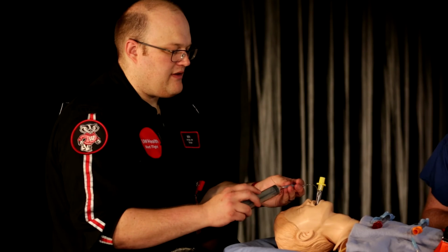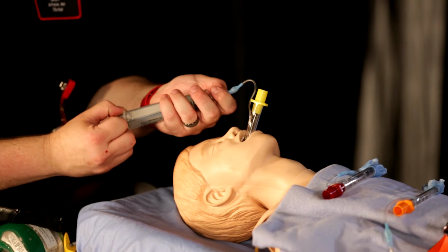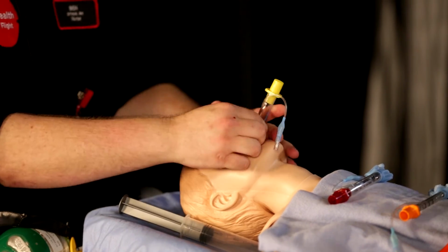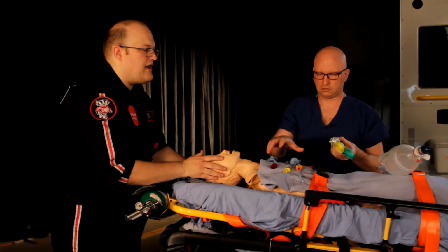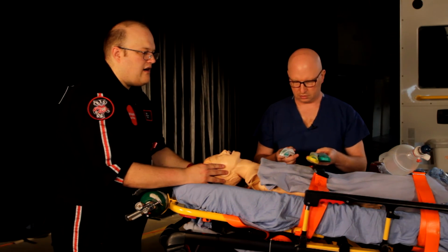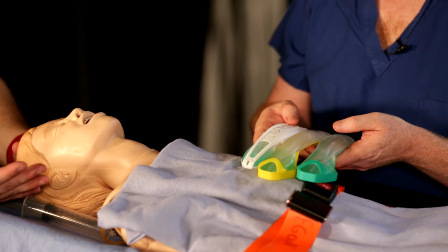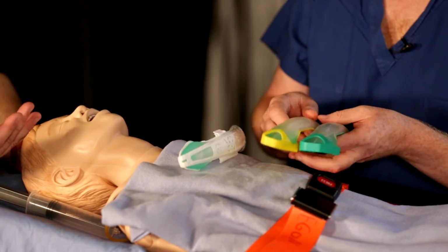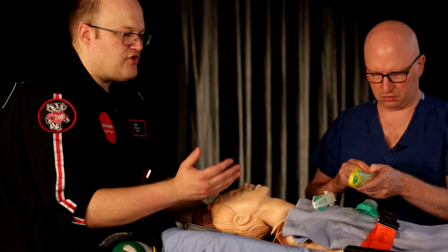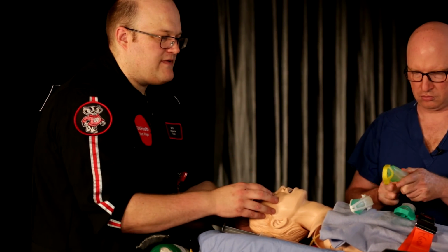And then I'll transition. So obviously this is going to be removed once the child is either waking up or you have a definitive airway situation. But we're going to now show you how to do the i-gels. So Dr. Kohler, again, if we can look at the 3 sizes that I think are most likely. So we're going to do a 2.5, a 3, and a 4.